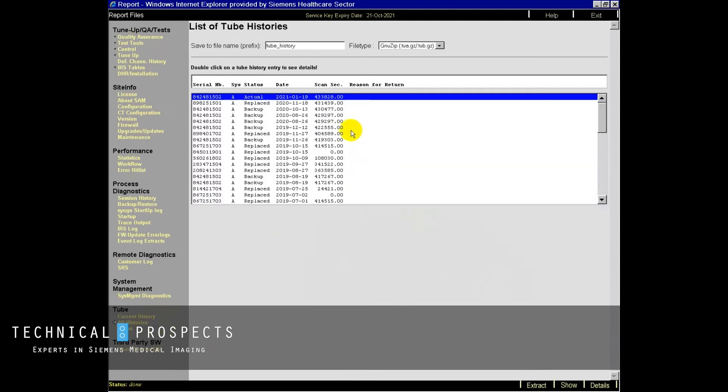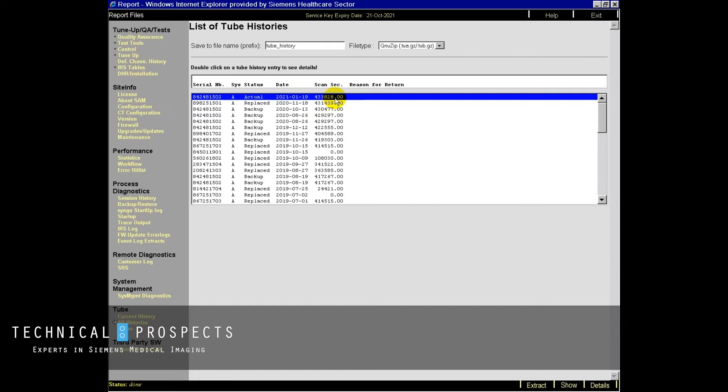And within here, you'll see our current tube. Here's today's date, January 19th, 2021. Scan second count, 433,828. And if you were to look when it was replaced, here's the actual replace date of the tube that's currently installed, which was 11-18-2020. And that tube went up to 431,439 scan seconds, for example.